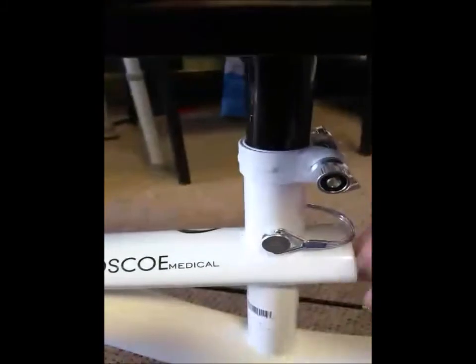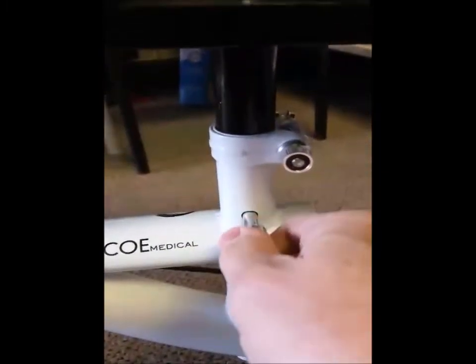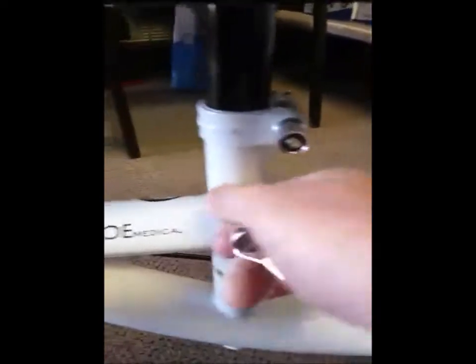On the bottom, underneath, is where you're going to adjust the height. There are two adjustments: one is a pin — you remove the pin and set it to the correct height that you desire.